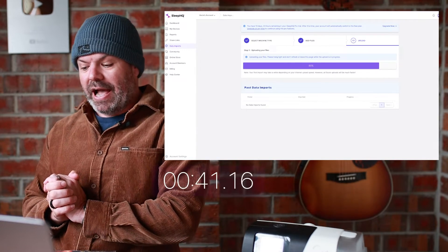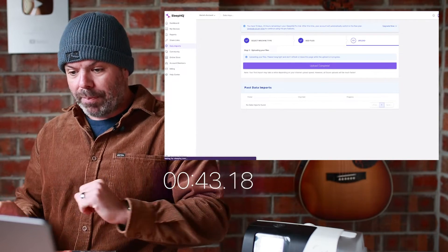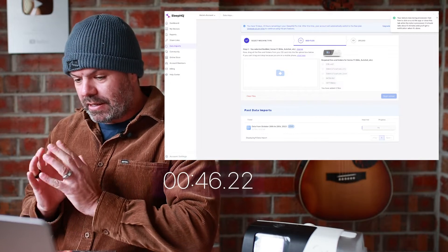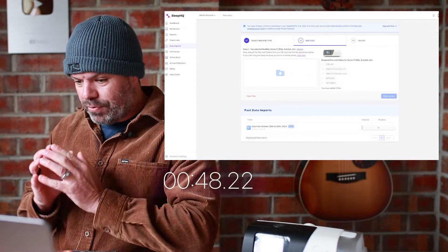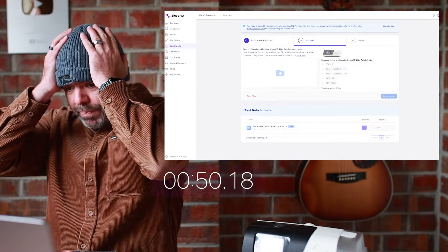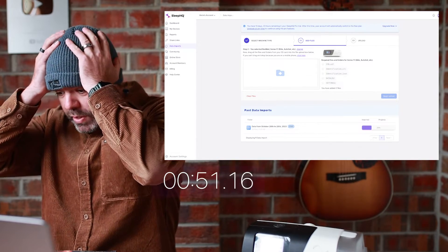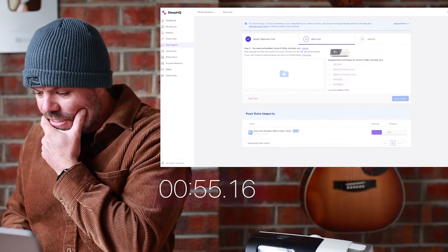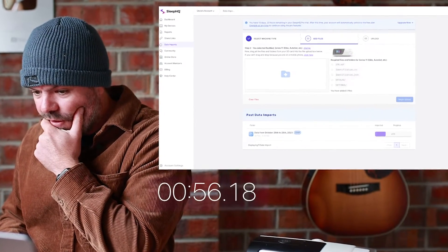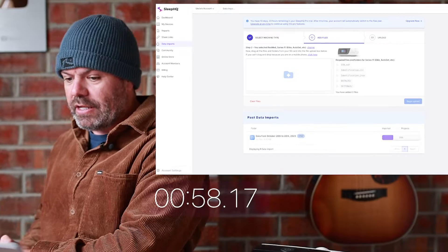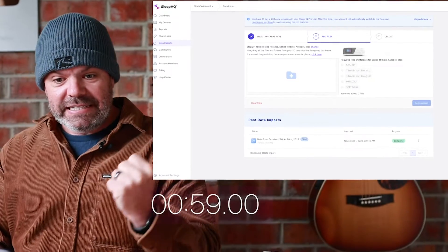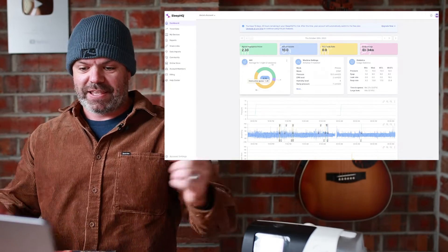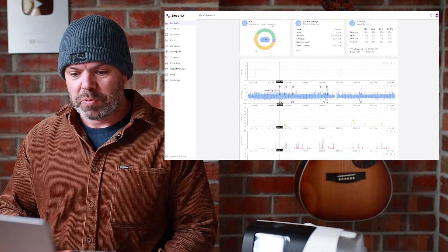Looking good — 87%, 93%, upload complete, processing. Come on baby, process! 1%, 29%... seven seconds, six, five, four, three, two, one — complete! Yes!